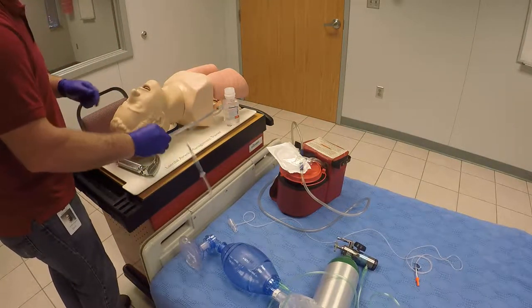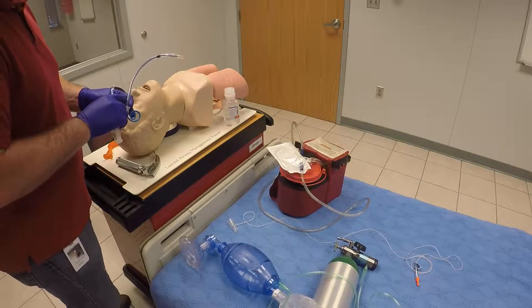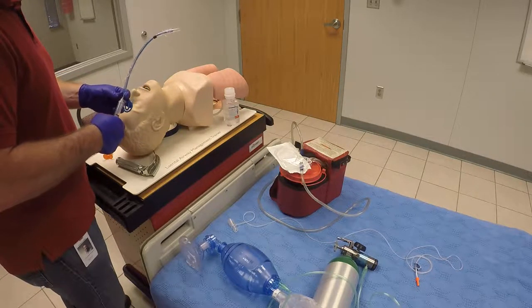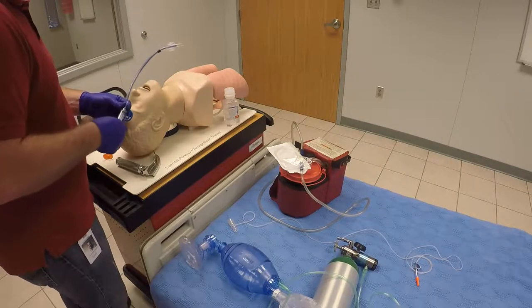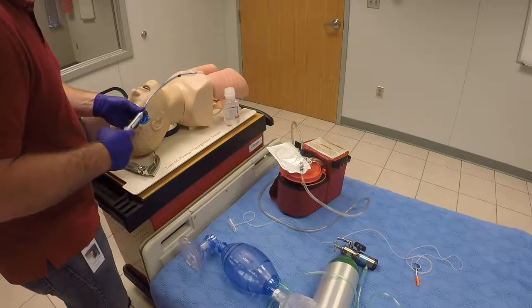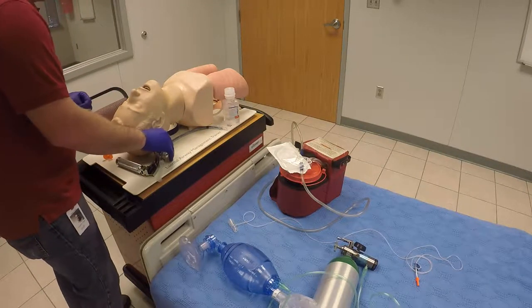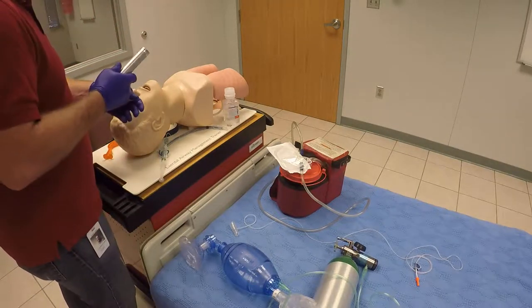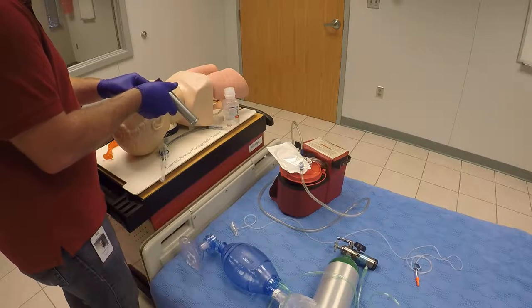I've got my ET tube here, properly sized — it's going to be a 7.0 that we're going to use. I also have a 10 mil syringe. I've checked my cuff to make sure there are no leaks and that it holds air. I need to make sure I have my capnography, and my laryngoscope is working — the bulb is tight and seems bright enough.